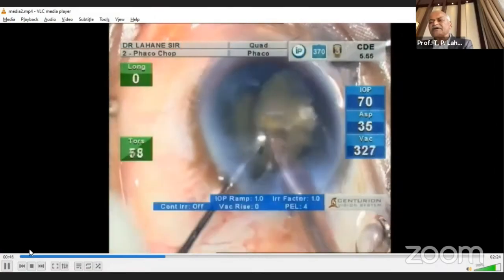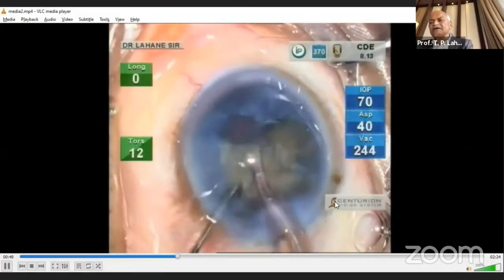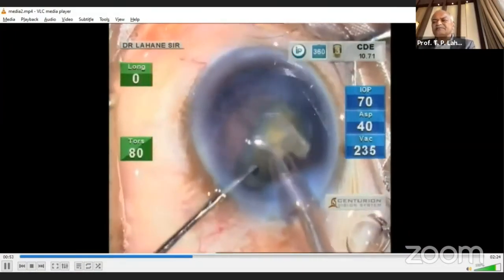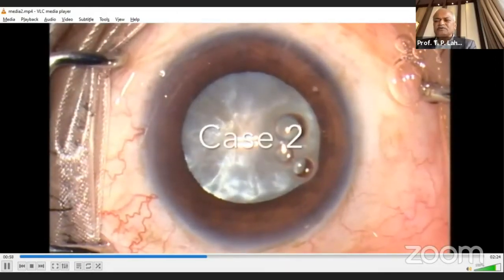And whenever you do it, if you take one piece, the other piece's sharp edge goes behind and it causes the PC tear. So always remember that the separation should be complete.